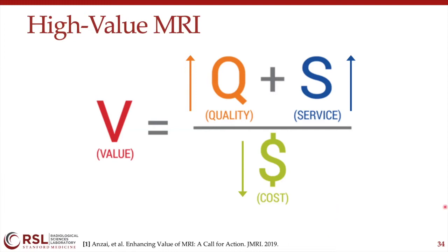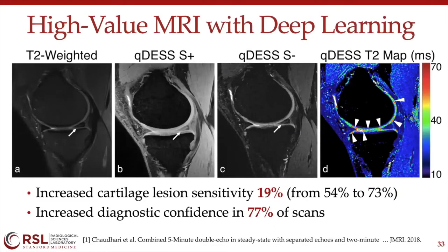Why does the thickness of the cartilage look thicker on qDESS+? What is the standard contrast weight for cartilage thickness measurement? Is this thickness measurement done routinely clinically?